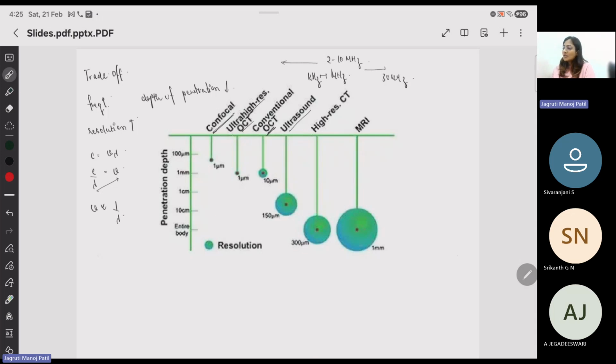However, the resolution based on lower frequencies goes to around 400 microns, whereas with higher frequencies it is proportional to 20 to 40 microns. So those are the ranges of differentiation that you get. It also depends on the point spread function of the imaging field and of the transducer that you're imaging with.